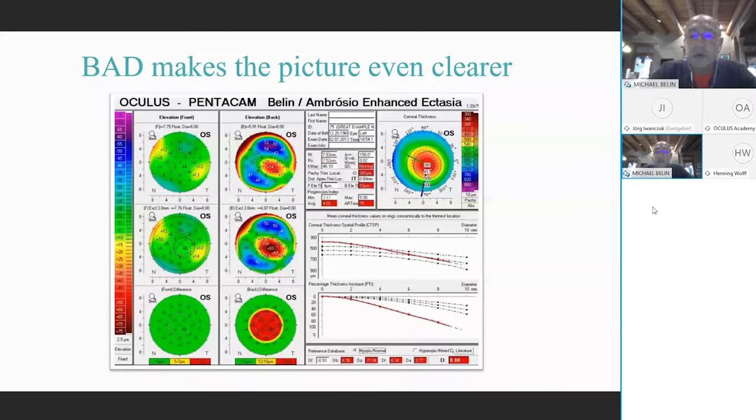This is a highly abnormal cornea, true disease, in spite of the fact that it's a normal anterior surface, in spite of the fact that the patient has good visual acuity, and in spite of the fact that Amsler-Krumeich views this as a normal eye.